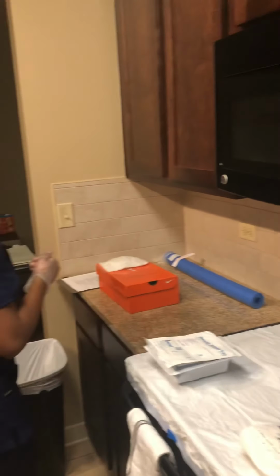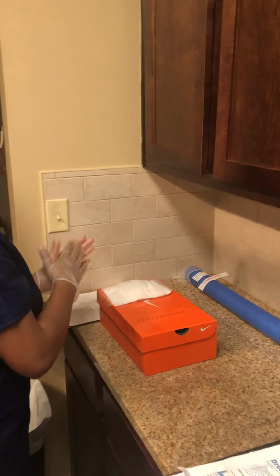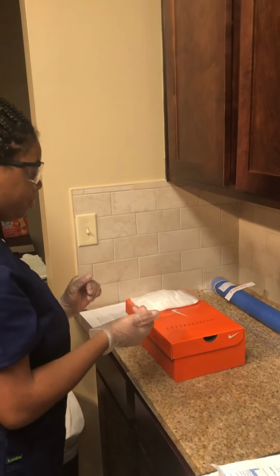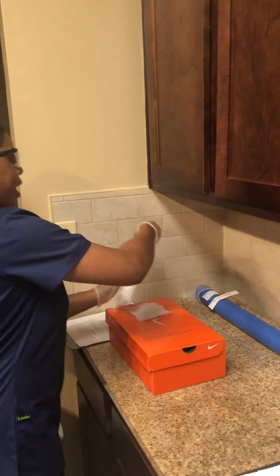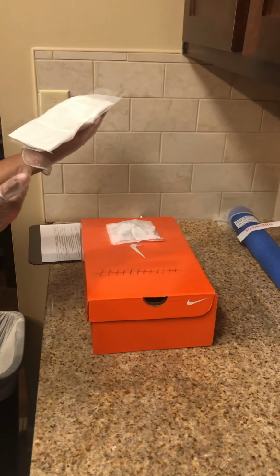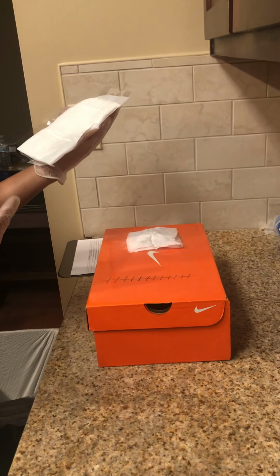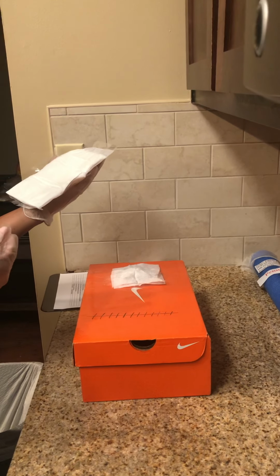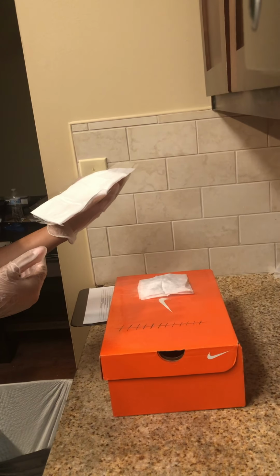I will now expose the patient's suture wound and the wound dressing while maintaining privacy for the patient. I will remove the dressing away from the patient and I will now assess the drainage. I will assess the type of drainage, the amount of drainage, the color and consistency of the drainage, and if there is any odor present.